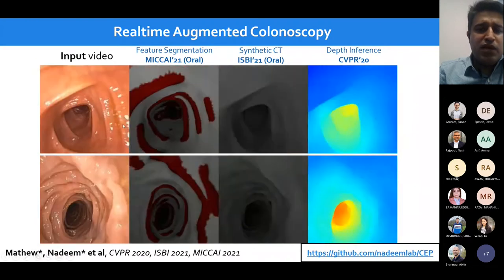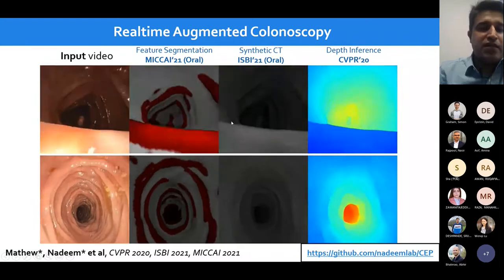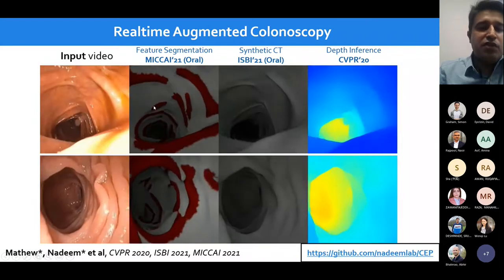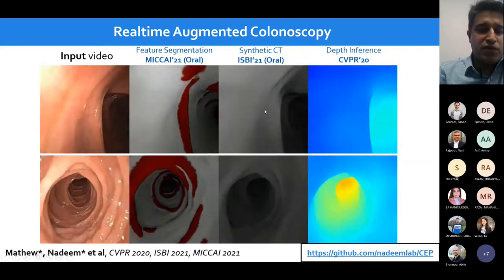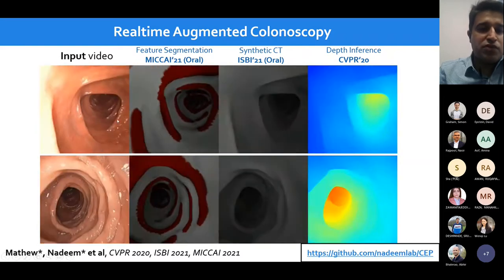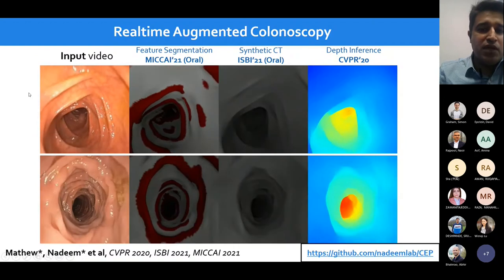This is where I'm going to highlight this part, where the use of orthogonal modalities, which is seeing the same information in two different ways, allows us to bypass some of the restrictions or limitations of just using one modality, similar to what we did with the CT and cone beam CT.